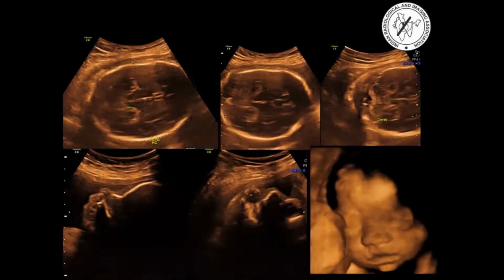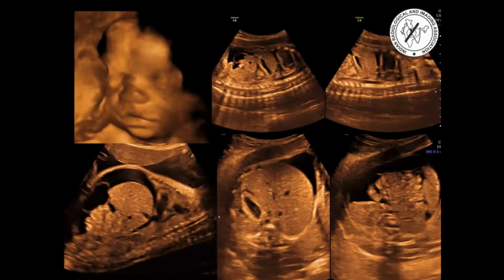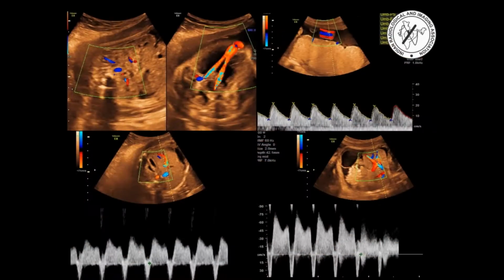So as routine, sonography started with BPD, HC, cranial structures, facial profile and orbits. All appear to be normal. But traversing through the abdomen of the fetus shows marked peritoneal fluid collection suggestive of fetal ascites. The stomach appears to be normal and bowel loops also appear to be normal. Then seen for the GUT, the kidneys and urinary bladder appear to be normal.